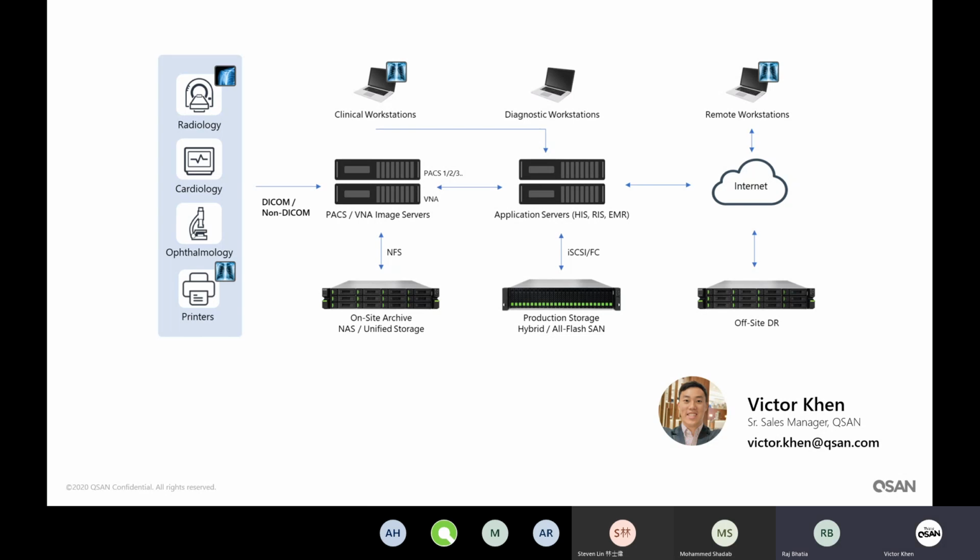Yes, just a quick question here. When you mentioned that you have the replication taken over between different devices for an offsite DR, is the format of replication identical amongst the filing system on the NAS, the FAS, as well as the SAN? No. The block storage would use different replication. So the shared replication will be between different NASes, and another replication will be between different SANs.